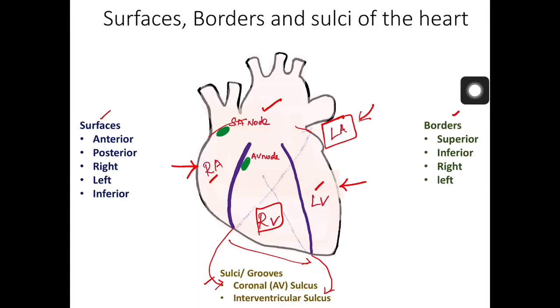So though this is the general description of the entire heart, when it comes to STEMI, we mainly focus only on the left ventricular walls. That is, when we say anterior, posterior, lateral and inferior, we refer to the walls of the left ventricle itself and not the entire heart, mainly because ST segment elevation MI is mainly due to the left ventricle.